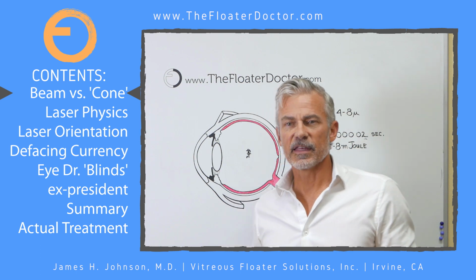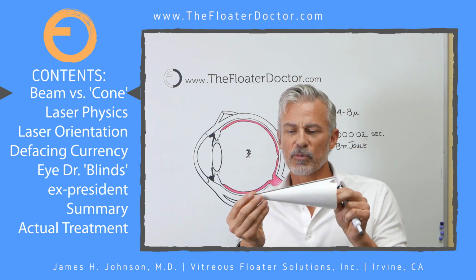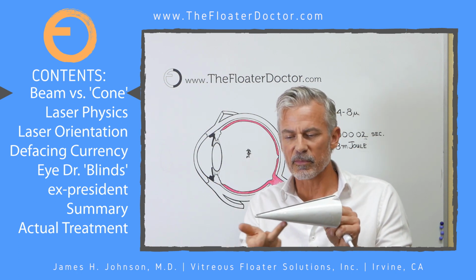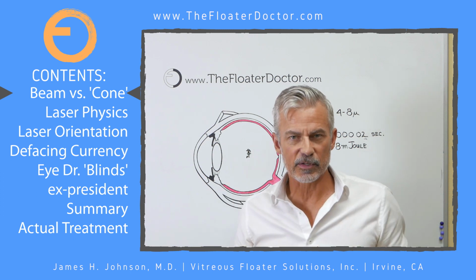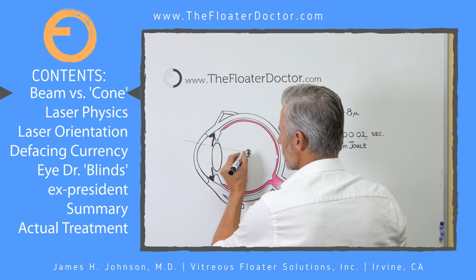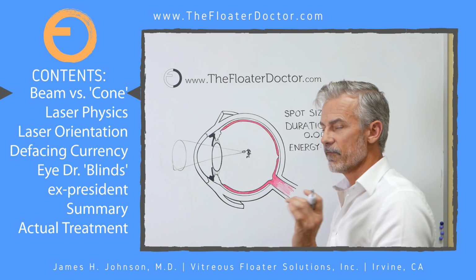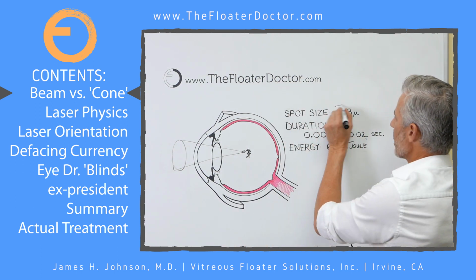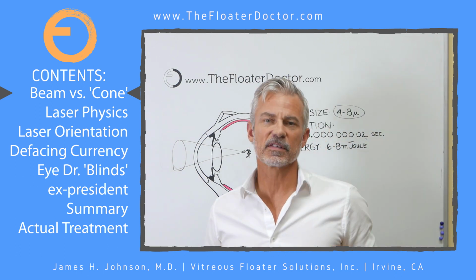So instead, this laser that we use has a cone-shaped energy profile to it like this. There's a red beam that runs along the top and a red beam that runs along the bottom, and where those two beams come together is where the absolute focus is. So schematically, we would have something like this, and the energy is only delivered there. Very, very small spot size, by the way. The spot size, in fact, is about 4 to 8 microns. That's between 4 and 8 thousandths of a millimeter.